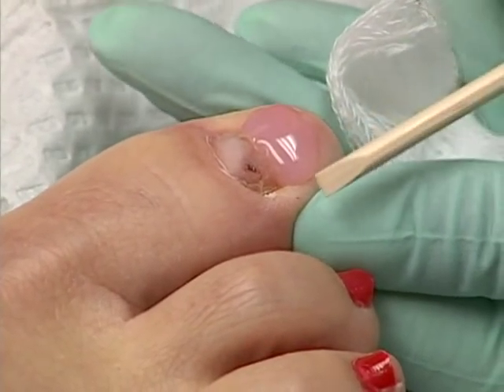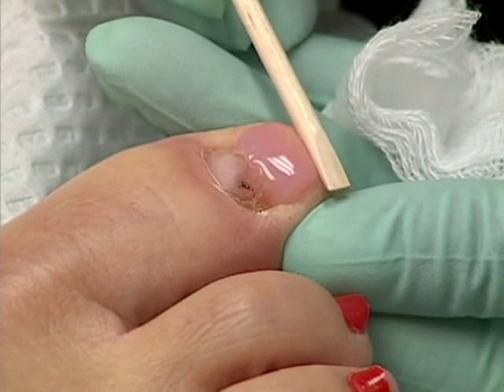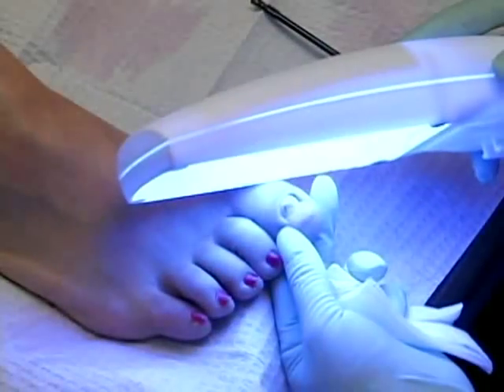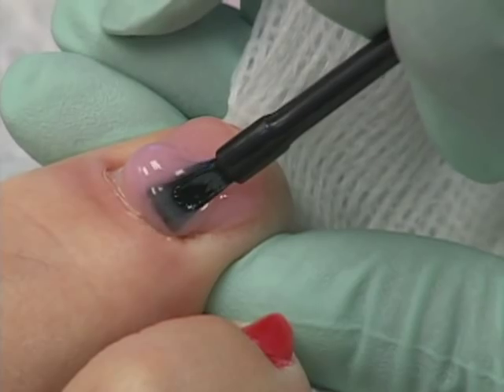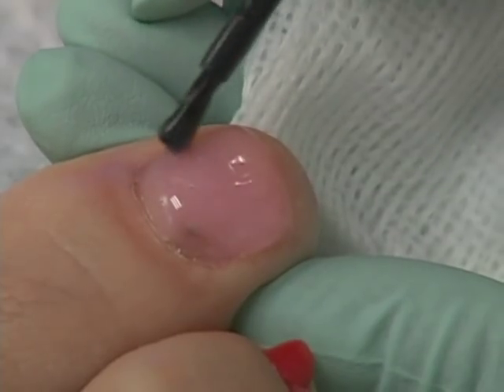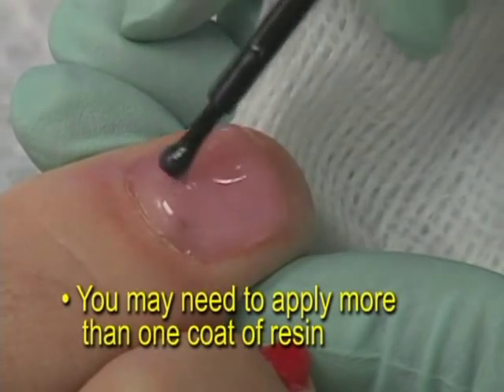You can remove any resin on the skin with a wood stick. The resin will not adhere to skin and, if cured with a UV light, will result in unstable adhesion and increase the risk of nail pops. You next pause to expose the toenail to the UV light for 10 seconds and then apply the next layer, anchoring the resin to the natural nail and stopping before the proximal nail fold to prevent lifting. Depending on the condition of the patient's nails, you may need to apply more than one coat of the resin to the nail.